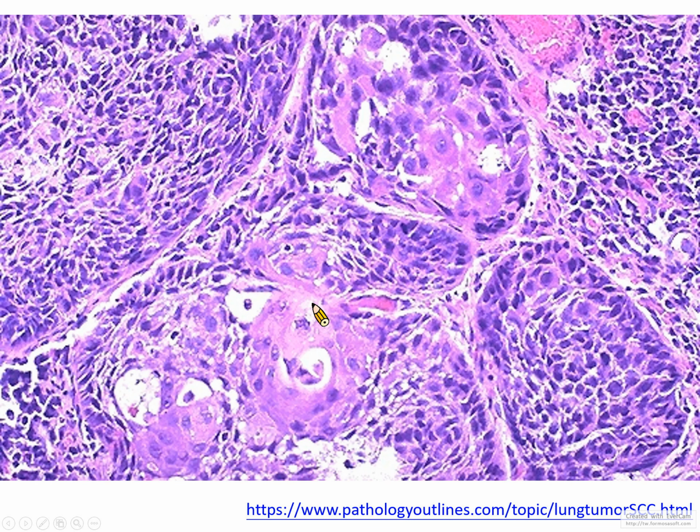Okay, so this is the final pathology slide. You see this frozen tissue. You can see that it is definitely an abnormal tissue because this is squamous cell carcinoma. There are lots of squamous cells growing in very random patterns, and this is definitely not normal.